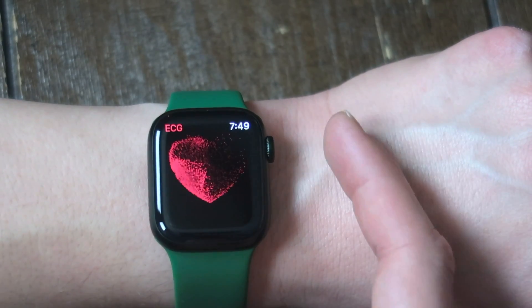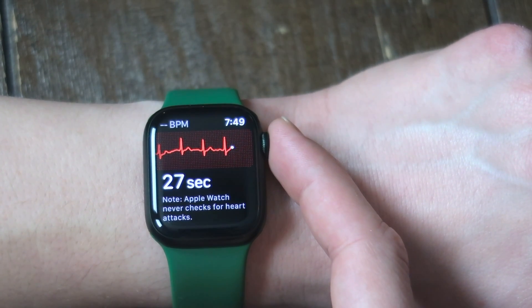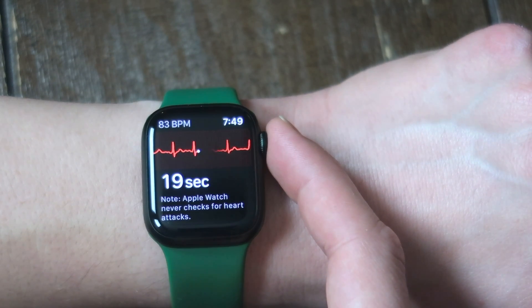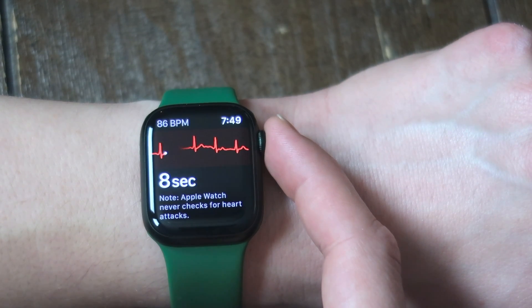What you do is you want to hold your finger — don't press, just hold it against the crown for 30 seconds. What it's doing is it's taking a pulse through the Apple Watch heart monitor, but it's also doing something with your finger and then using algorithms to tell you if you have atrial fibrillation, I think it's called. But I'm going to be quiet and stop talking. My heart rate's going up.